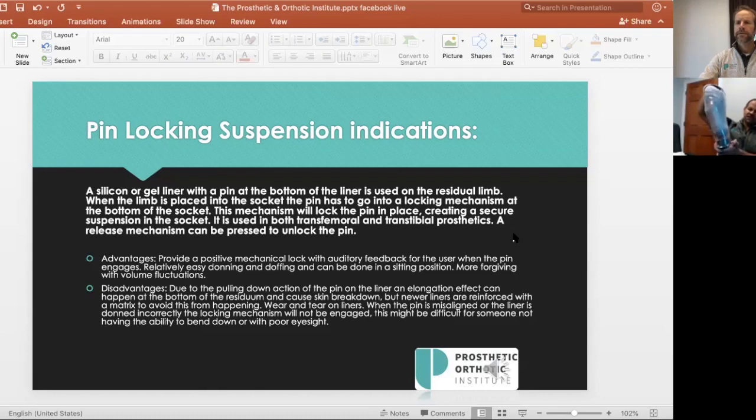I've used this specific type of socket this morning so you can actually see inside. This is engaged again through the pin locking mechanism. What's key with this, again, as we talked about earlier, is the vertical stretch, right? As your patients are ambulating, you can see just how much vertical stretch. So a 3-pound to 4-pound below knee prosthesis that a patient is ambulating on, and throughout the day they're weight bearing through here, and then they're actually picking up their prosthesis. You can see the amount of travel that I have with my hand. This is a prime example of pistoning that's happening inside the prosthesis.